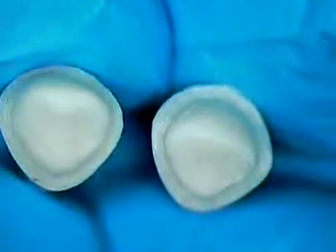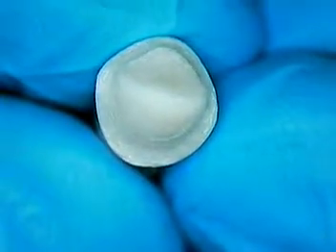Let's take a good look at our final product. There was our goal, and there's our final. Back off the magnification a little bit — just comparing the two. Looks like we did pretty well today. Keep practicing — that's what makes a really good dentist, not an average dentist, but a dentist that is really committed to doing dentistry at a high level. Take it step one, step two, step three, just the way I showed you, and you should come up with a nice result. This is Dr. Jerry Cuomo. We'll see you on another update when they come out — we'll have more teeth available as well. Take care and keep practicing.